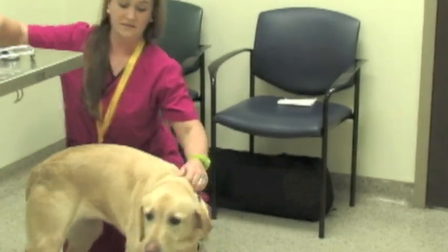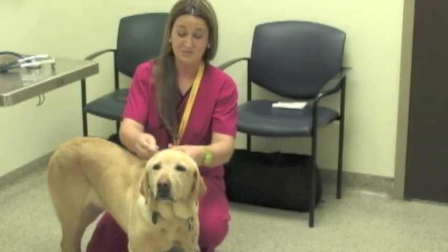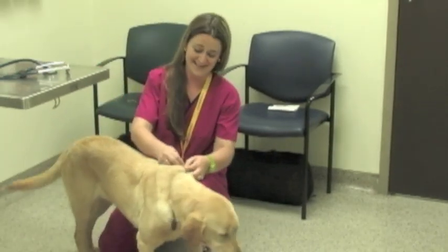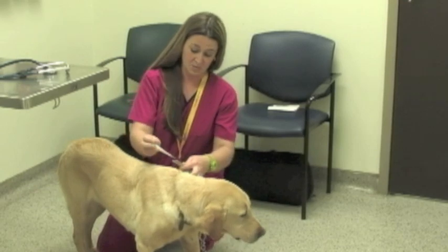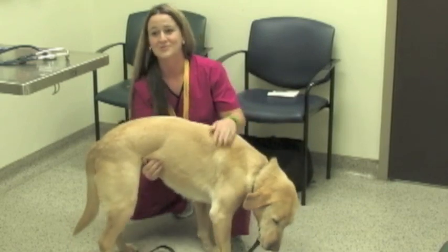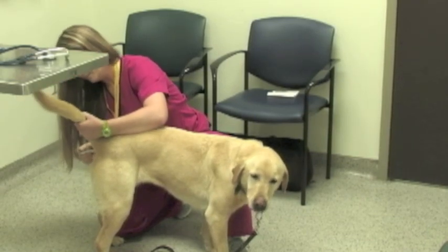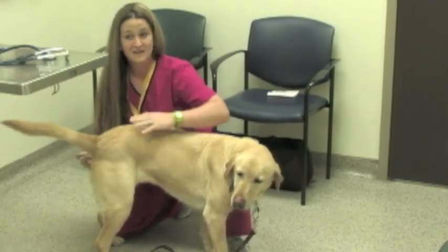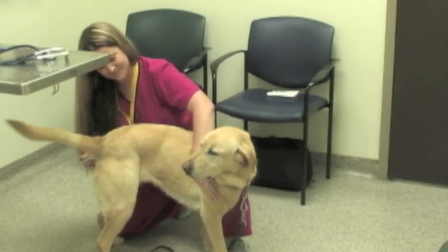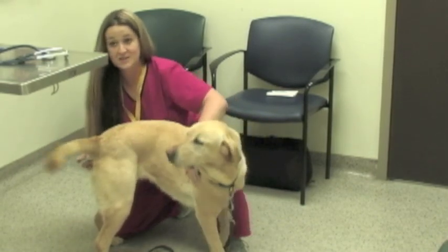The next vital sign I do, which is also the last one I typically do, is their temperature. It's their least favorite thing, so obviously I like to keep it to last. Most of the time I would have somebody hold the patient's head for me, but since this is my personal dog I know she'll stand still for me. You just talk to them and make sure they're okay with everything. Ideally you want a fast thermometer for this procedure, and not all patients are as good as she is for this.